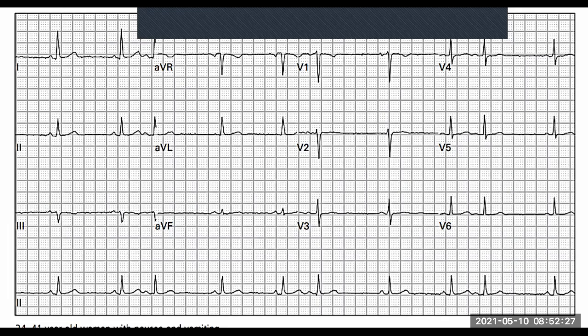I always maintain the important thing is whatever you can get right, get right. Whatever you can't recognize, it's not an issue, but make sure that you pick up abnormalities. And if you're not sure of the diagnosis, ask. The worst thing that you can do is just say, I'm not sure, you are fine, go home, because there may be something serious going on. And the only way you can know abnormal is to know normal.